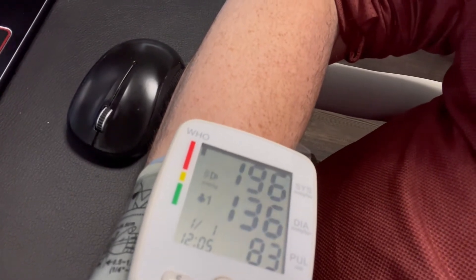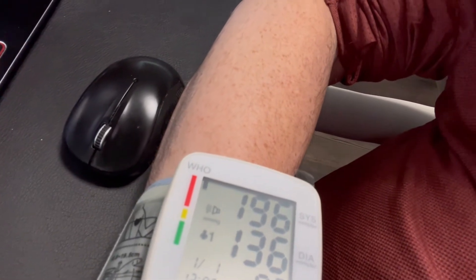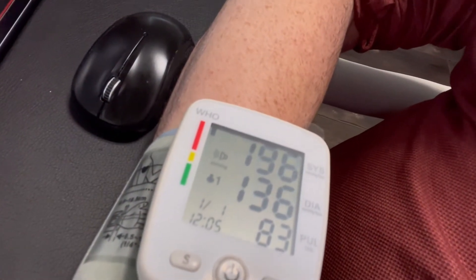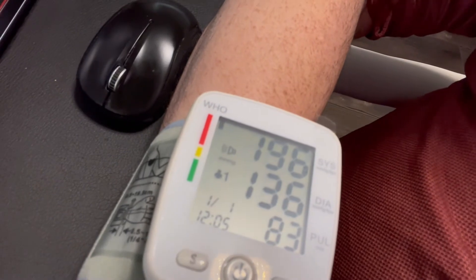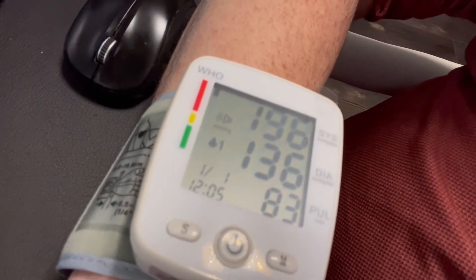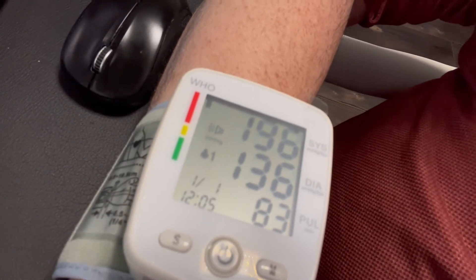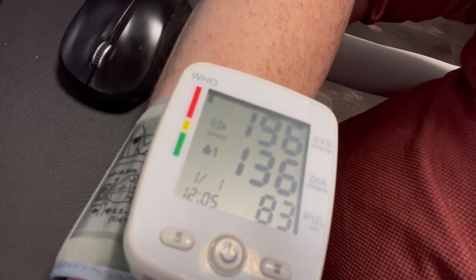Your blood pressure is: systolic 196 millimeters of mercury, diastolic 136 millimeters of mercury. Your pulse was 83. Your blood pressure is abnormal. ...Abnormal.